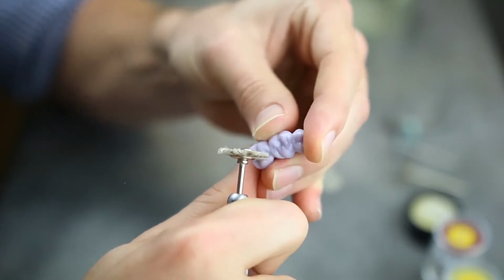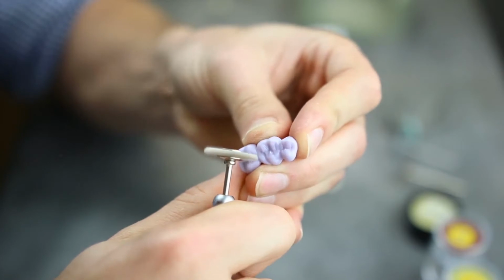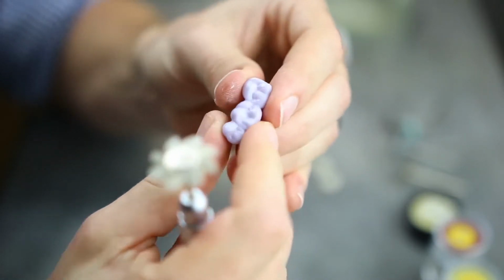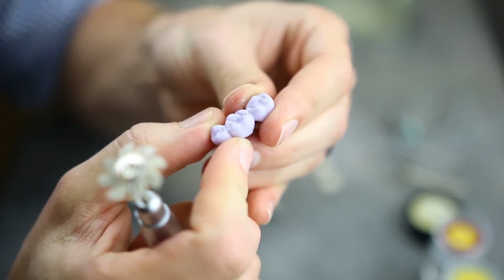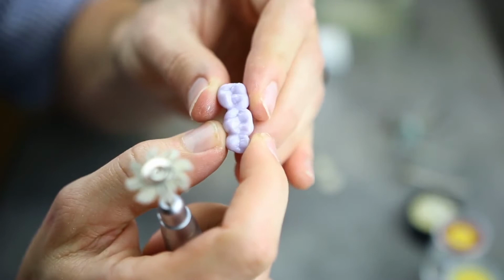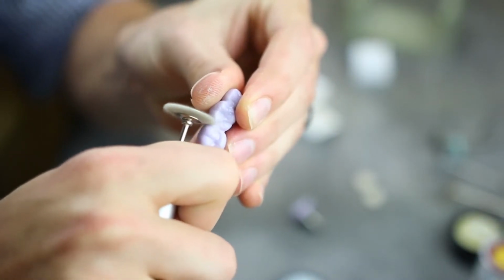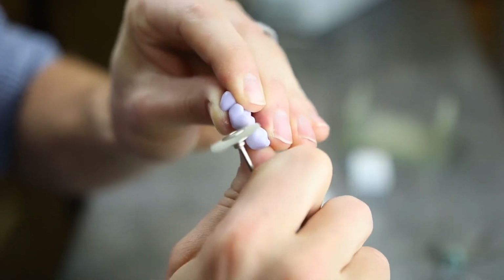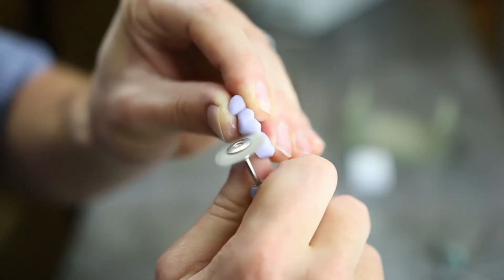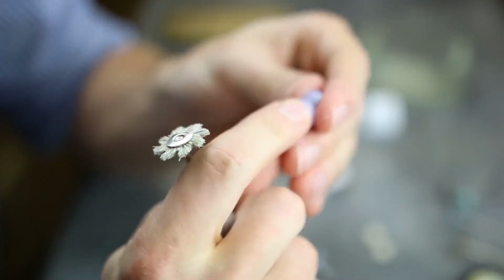And that's why we use this special occluso brush from DiaShine, because of its shape and the texture and how hard those bristles are, it's like a medium bristle brush. All of those components put together with this compound just mean that it's a very easy process to get an incredible high shine without too much effort. And you'll find that, within a couple of minutes, you'll have that really nice high luster finish, and you can take it into the interproximals as well, for example, on a bridge restoration, like I'm showing now, without too much problem at all. Now, I don't use this occluso brush for my smooth surfaces. I just use it for the occlusal, and I always want to start there when I'm doing my restorations.